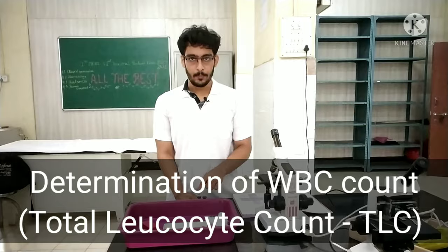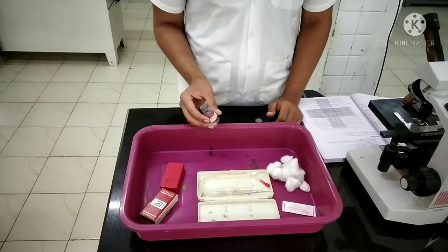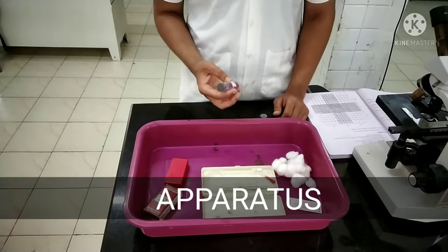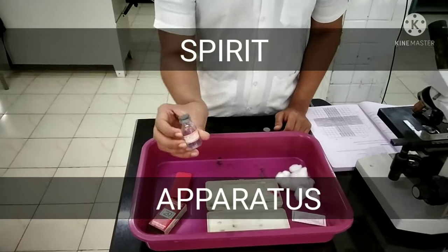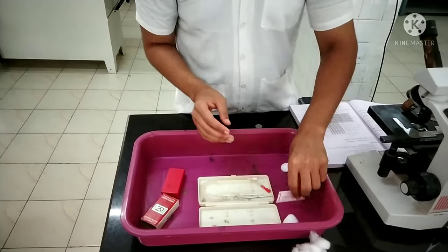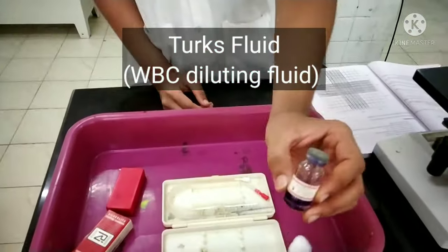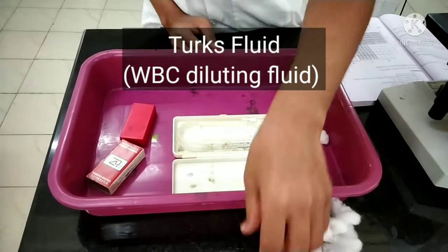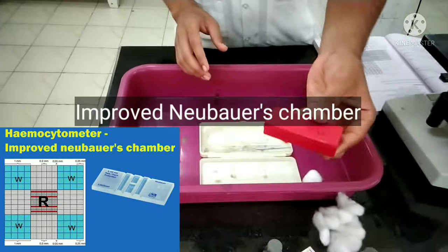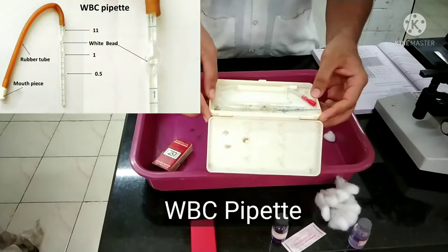First we'll check the apparatus for the experiment and then I'll tell you the procedure. The basic things we require are spirit, some cotton, a lancet. Other than that we require Turk's fluid or the white blood cell diluting fluid, the Neubauer chamber and the white blood cell pipette.